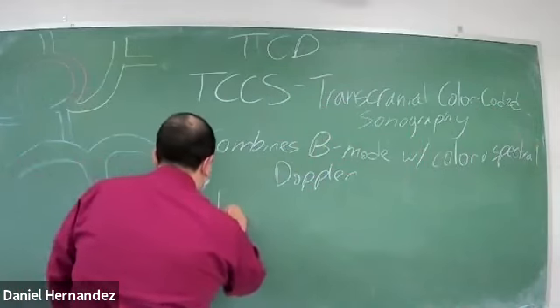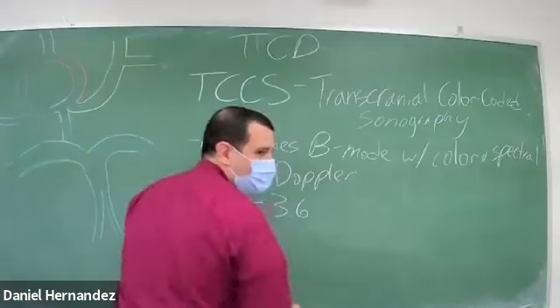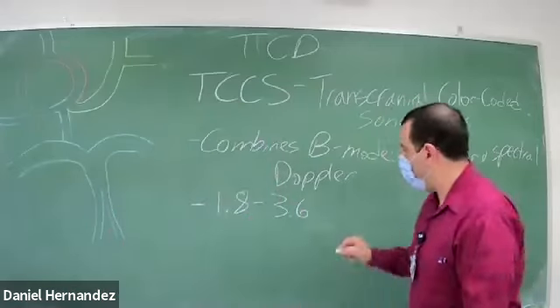With this one, we use a 1.8 to 3.6 megahertz phased array.